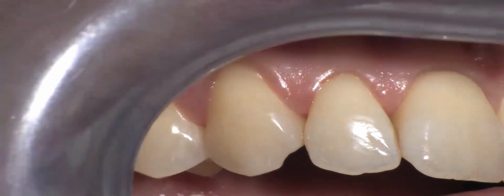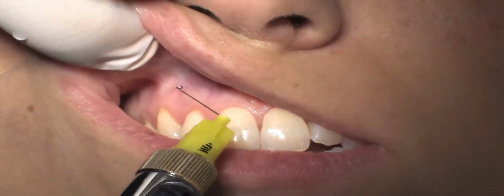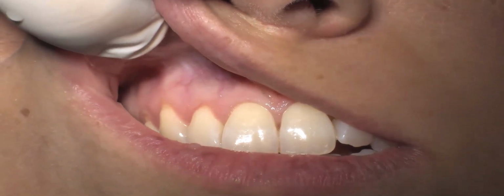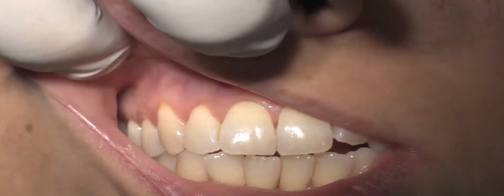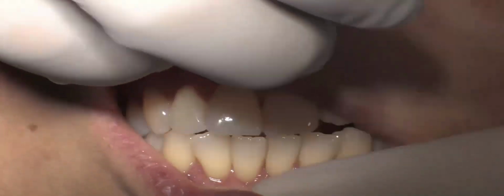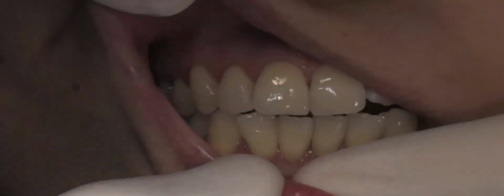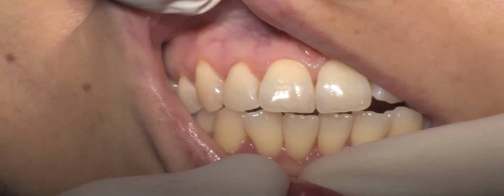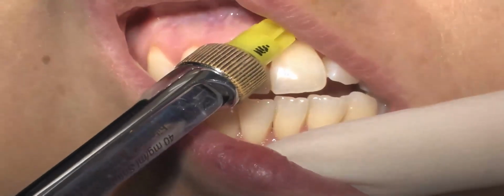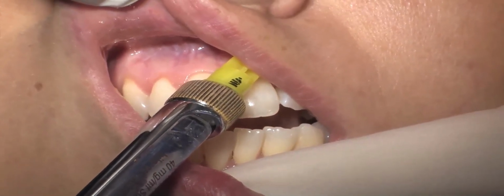Now we make anesthesia. I turn the needle towards the area to be treated, and since the teeth to be treated are the canine and the premolar, and also the lateral, I make anesthesia at the level of the central.